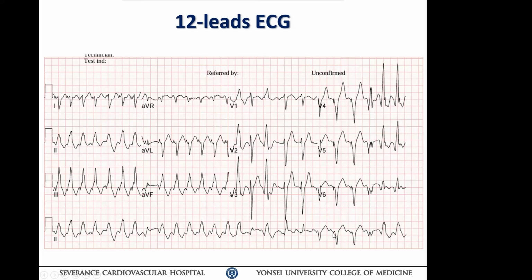So not the ECG interpretation, but in the clinical sense, V pacing in this tachycardia status, this patient may not have a pacemaker, but probably a high energy device, ICD or CRT, and also the wide QRS in between the wide QRS rhythm. There's different QRS morphology intermittently. So first 8 beats, yeah, rhythm strip, yeah. And it occurs again, same rhythm in the middle of the ECG, another one, and changes to a narrow QRS.